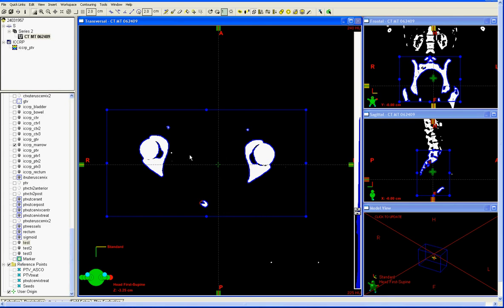Those are some techniques available in Eclipse for bone marrow delineation. You want to contour the outer boundary of the bone and fill that in, treating the bone marrow as a solid continuous structure. The regions contoured should include all of the pelvic bones — the ilium, ischium, and pubis — as well as the L5 vertebral body, the entire sacrum, the acetabulum, and the proximal femurs. The superior extent should be at the top level of the L5 vertebral body, and the inferior extent should be at the level of the ischial tuberosities.